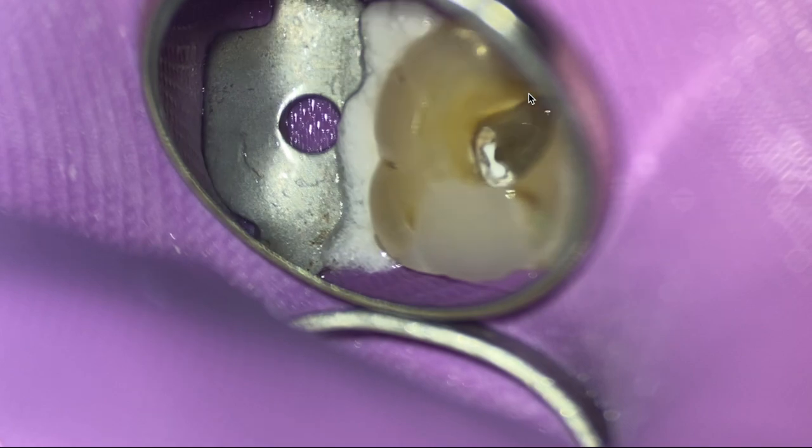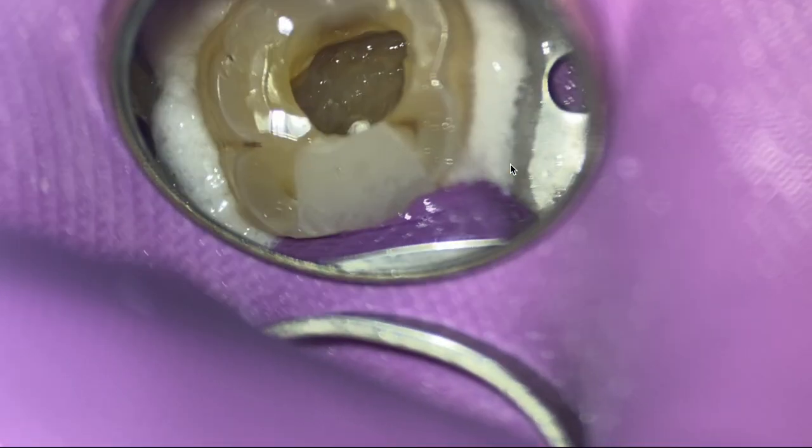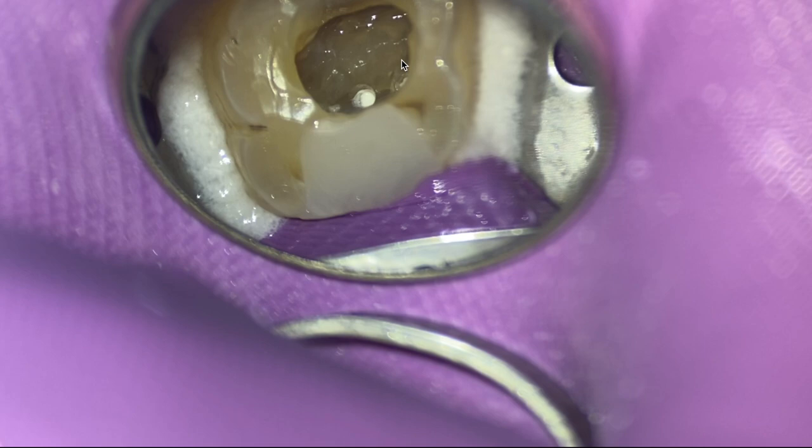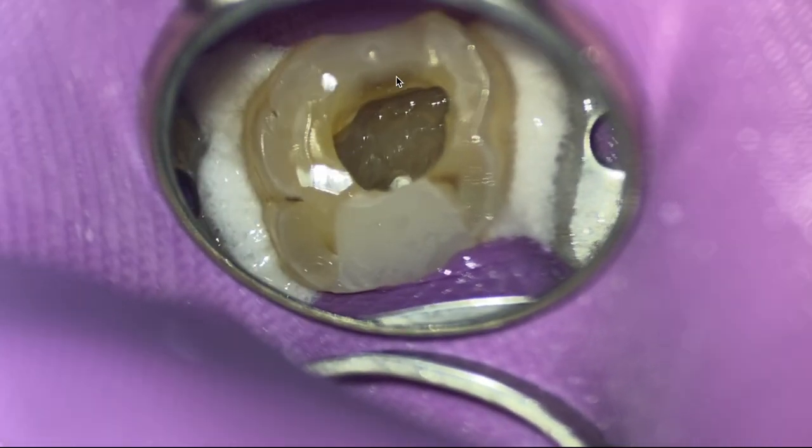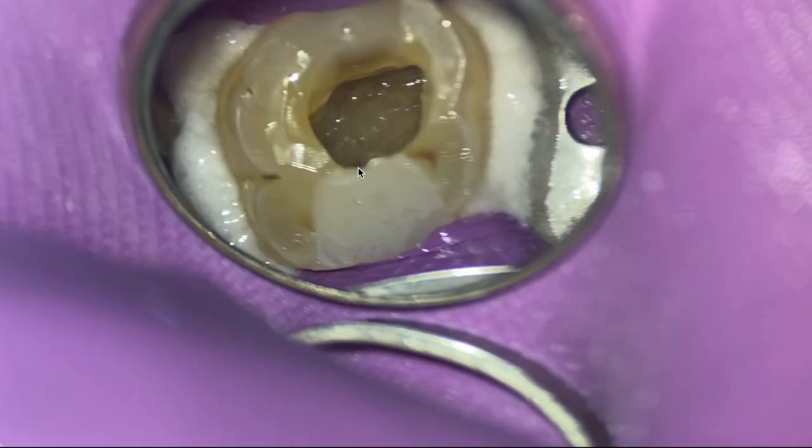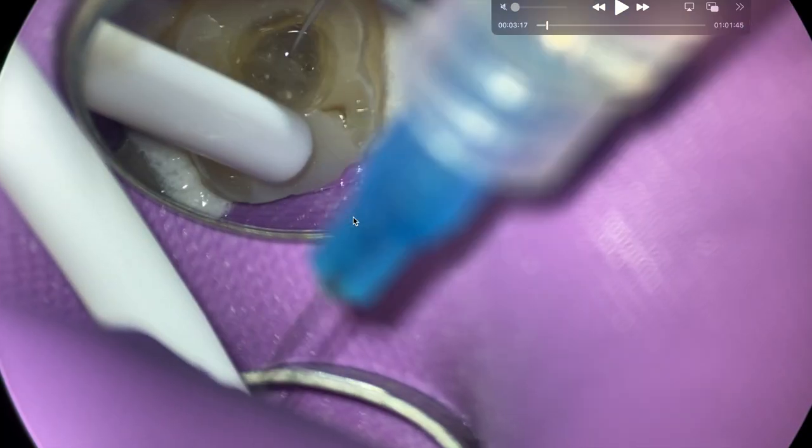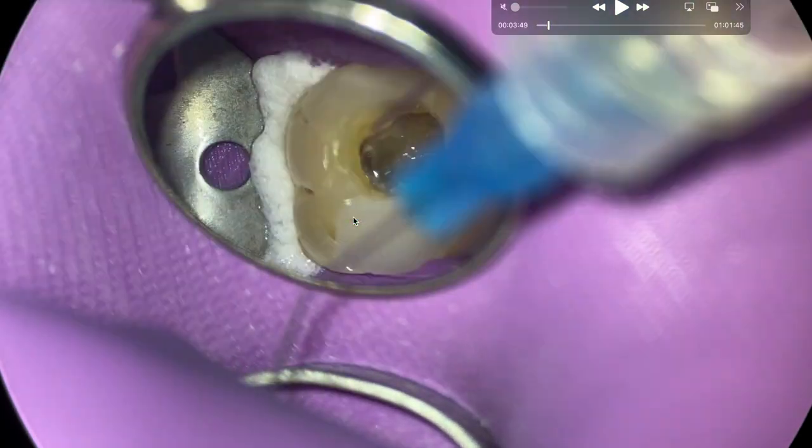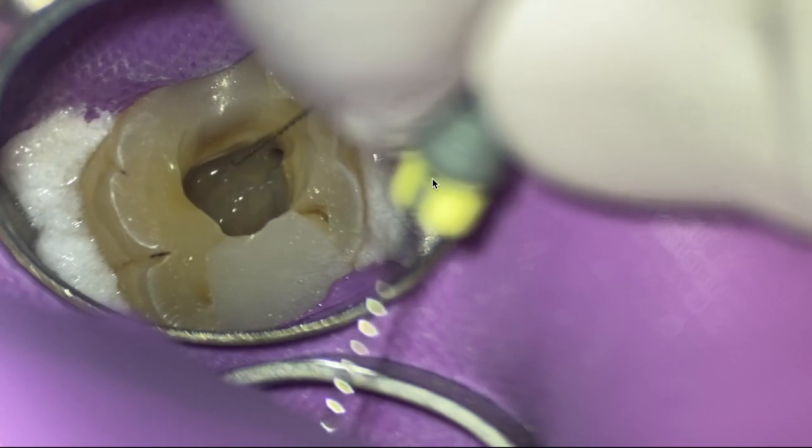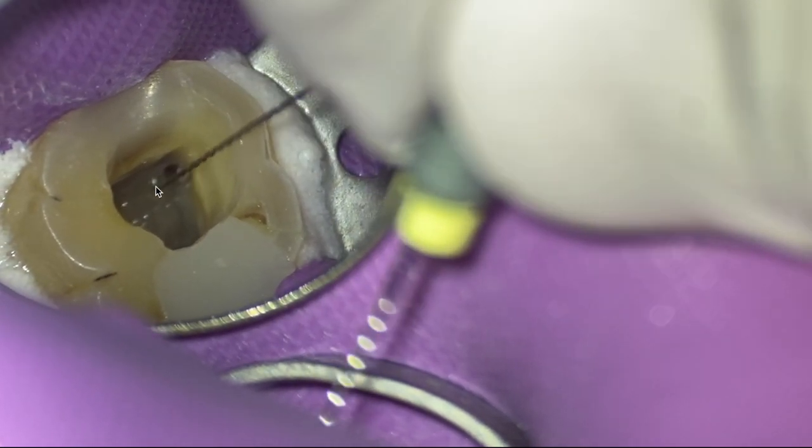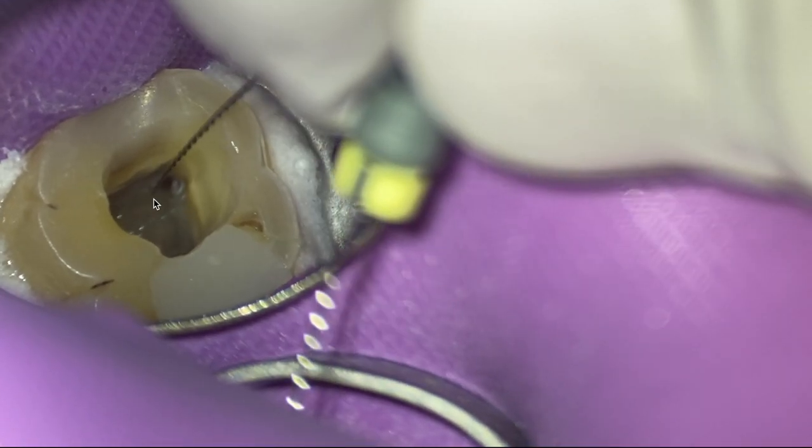We can see we've got calcium hydroxide in our palatal canal, in both distal buccals. There's DB1, DB2. I wish I had recorded it when I initially sat down, but when the other dentist needed me to take a look at MB2, we took a slow round burr and removed all the calcification along that portion there, and it unroofed that distal buccal too. So we're going to rinse out with some sodium hypochlorite. What you're seeing here, this is a really stiff C plus file. I don't typically use these, but I'm trying to hook in.